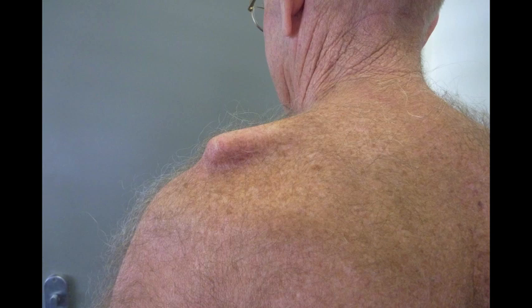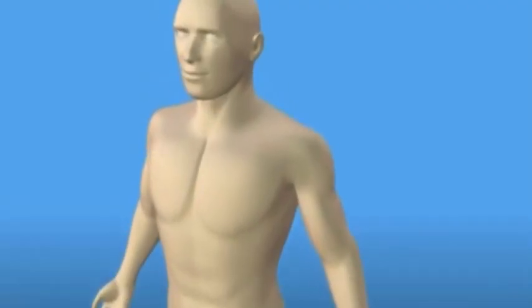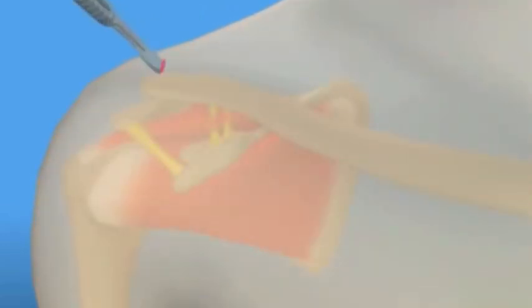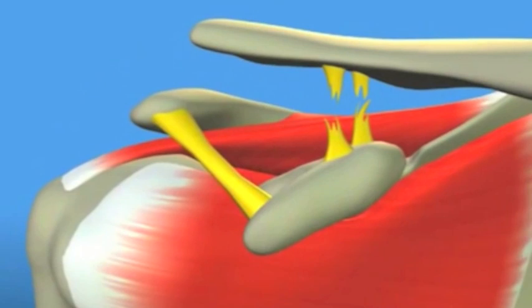The following video illustrates one of the surgical techniques that can be used to repair this injury. An incision is first made in the skin. There are many different incisions that can be made, but in this case we are illustrating one that goes from top to bottom. A saw is then used to remove a small section of the end of the clavicle which has been damaged beyond repair.